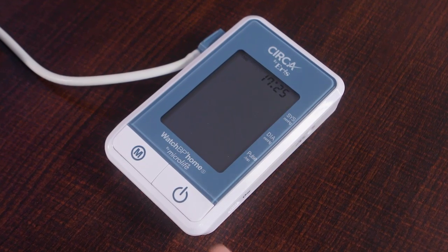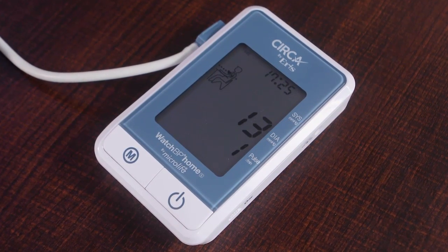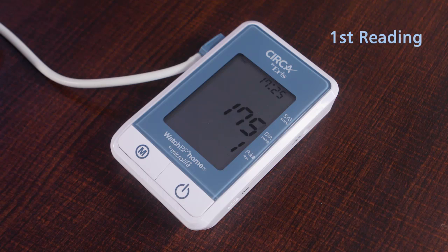Once in position, press this button. Wait for 15 seconds. After 15 seconds, the cuff will start compressing. You will then feel the pressure, and then it will deflate, releasing pressure.